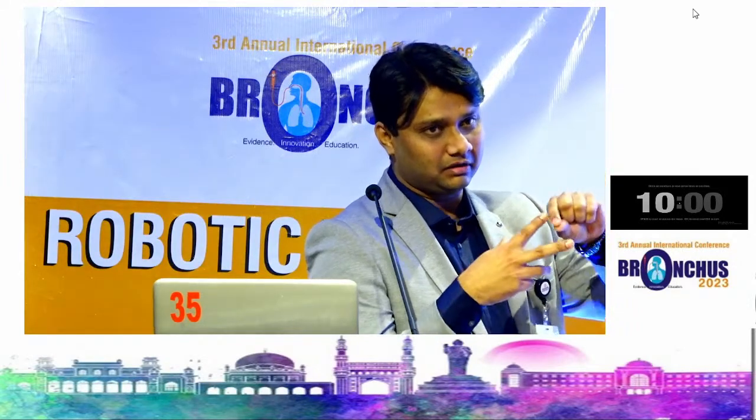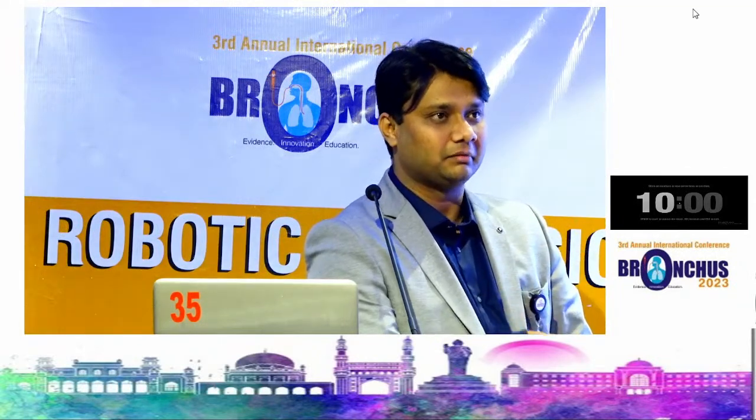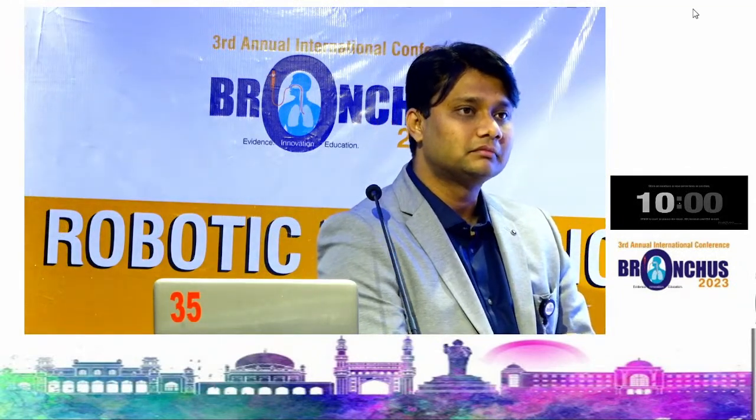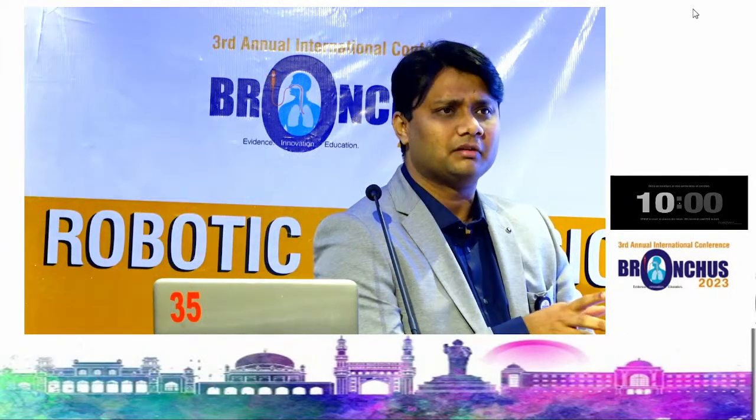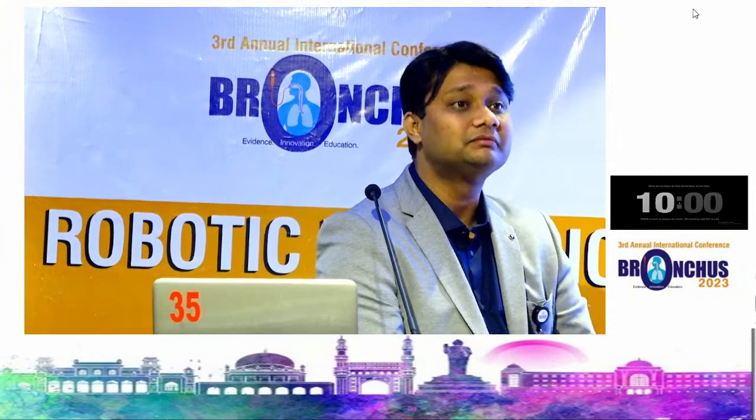But then I saw that the failure was mainly because there were some staple lines coming at the crotch of the staplers. So I think that was the main reason for the failure. Purple is also available, I think. No, purple is not available. Blue is available.